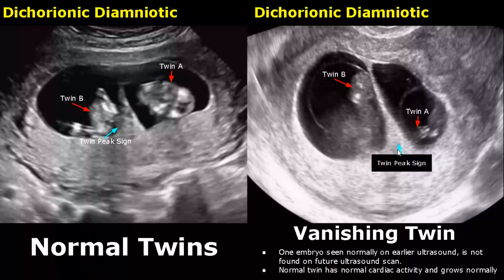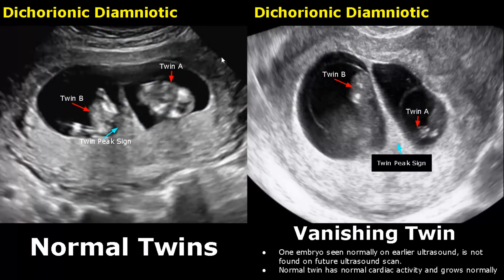In dichorionic-diamniotic twins, the fetus expected to be delivered first is the presenting fetus and is labelled twin A — it will be close to the cervix. The other twin is labelled twin B.